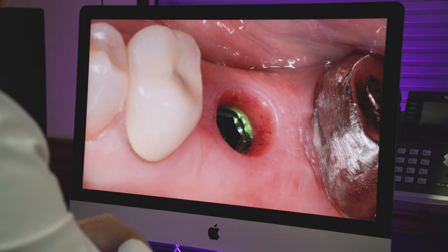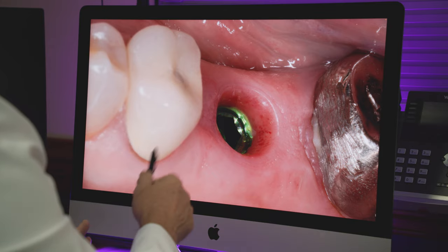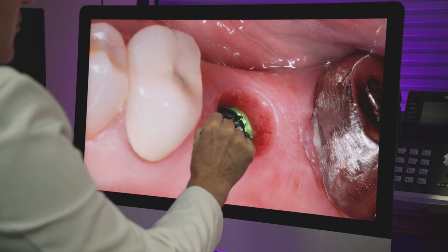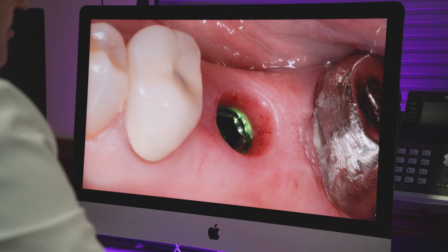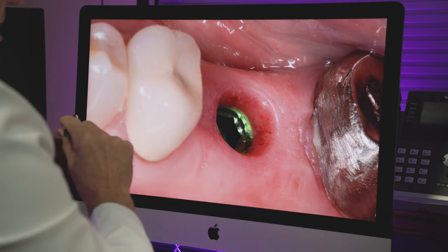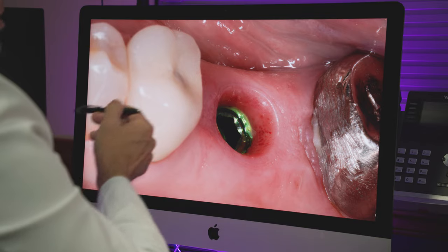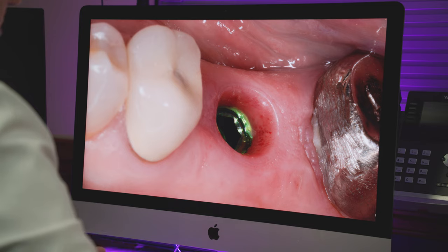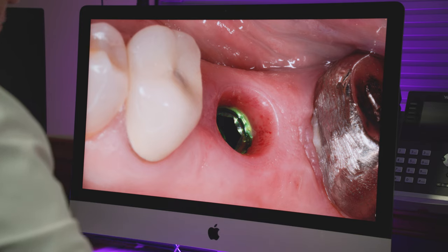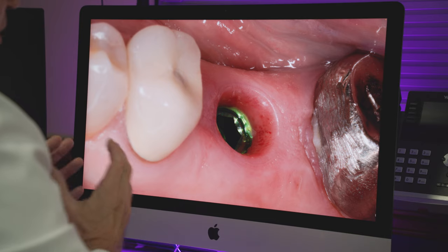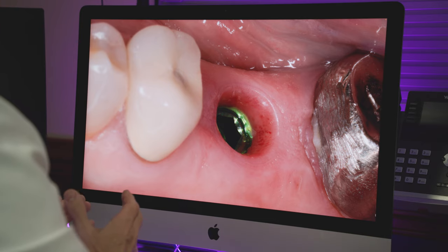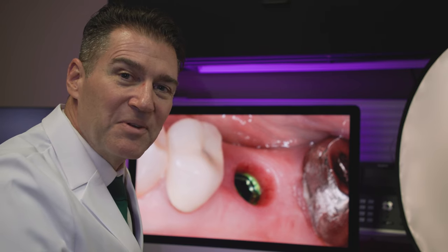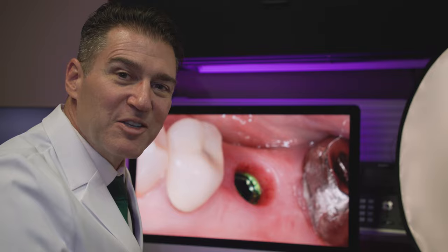You can see clearly from this picture — and I've never seen it in my entire clinical career — that if I look down in here, I would see a millimeter or two millimeters of bone sitting up above the platform of my implant. It may look like that in the radiograph because the lingual bone is higher than the buccal bone in most cases, but clinically there's a nice tight epithelial seal. So I hope that helps to clarify the difference between crestal bone loss versus wound healing immediately after implant placement. This has been another episode of Implants Made Simple. I'm Dr. Robert Stanley, Smile Engineer, out.